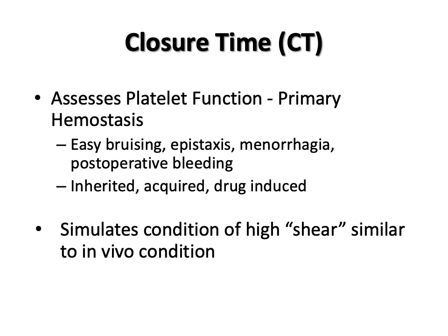The closure time assesses platelet function in vitro by simulating high shear conditions that are similar to those found in vivo. Since platelets play a critical role in primary hemostasis, abnormal platelet function may result in easy bruising, frequent and heavy nosebleeds, and heavy periods. Platelet disorders can be inherited, acquired, or drug induced.